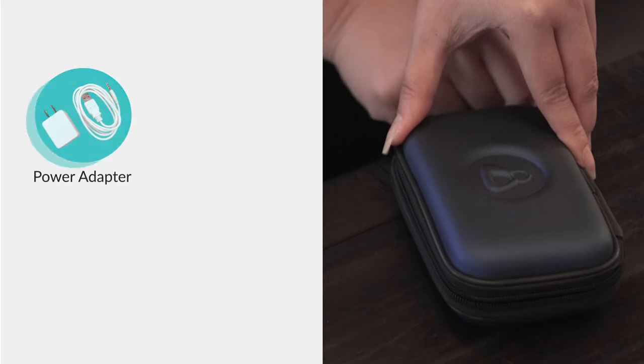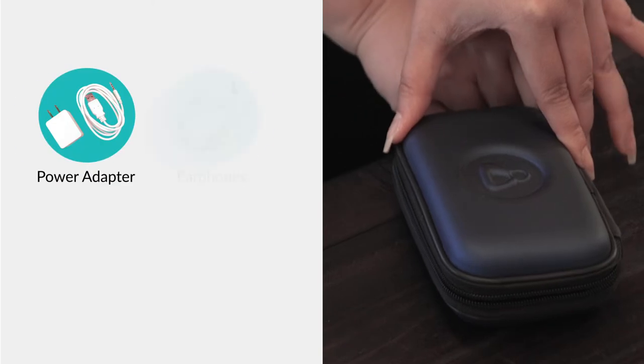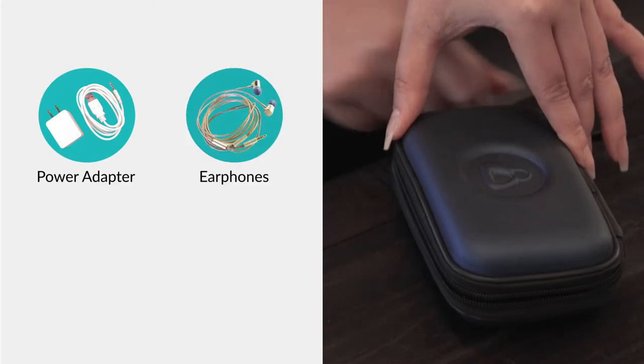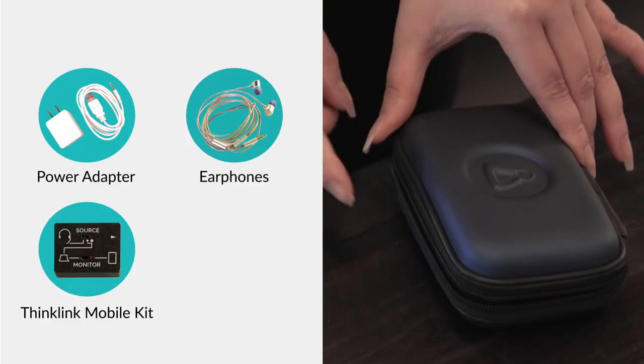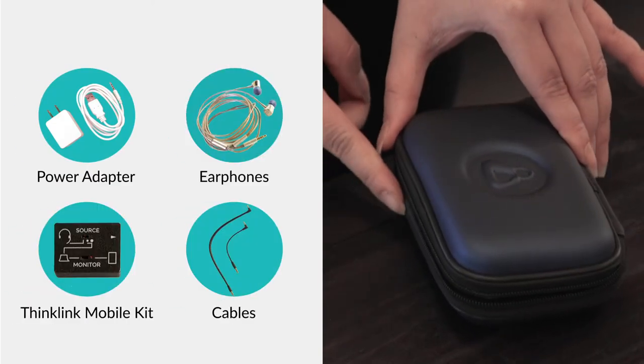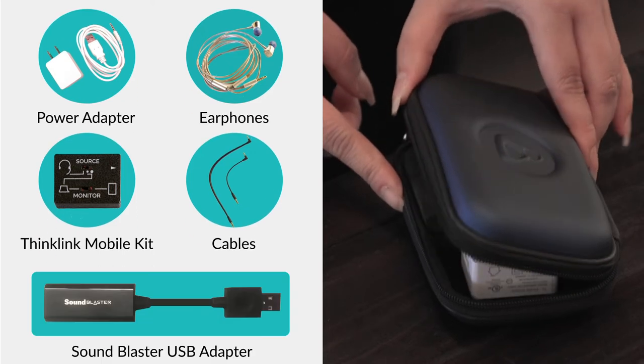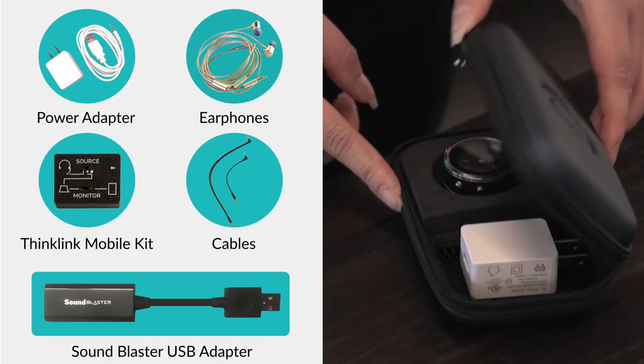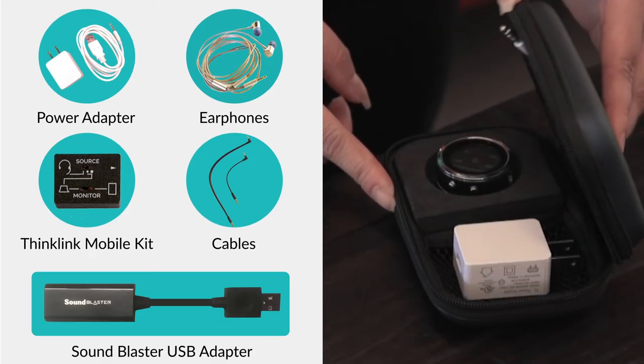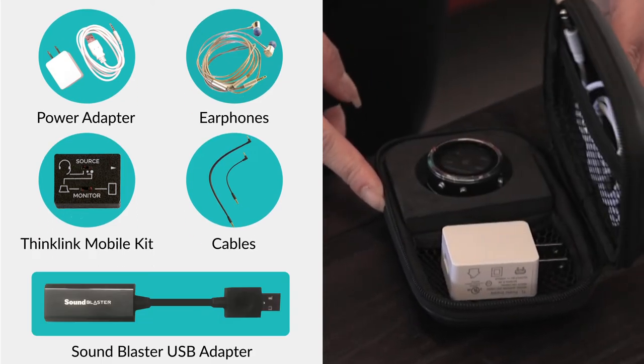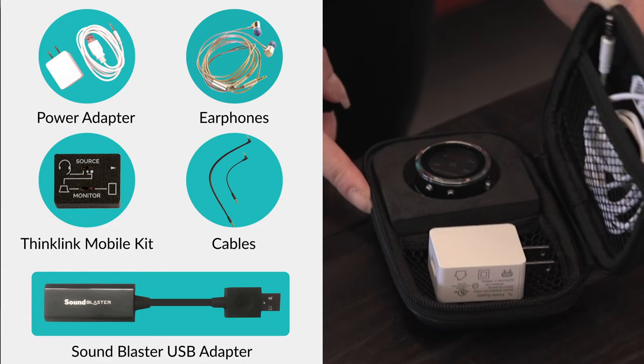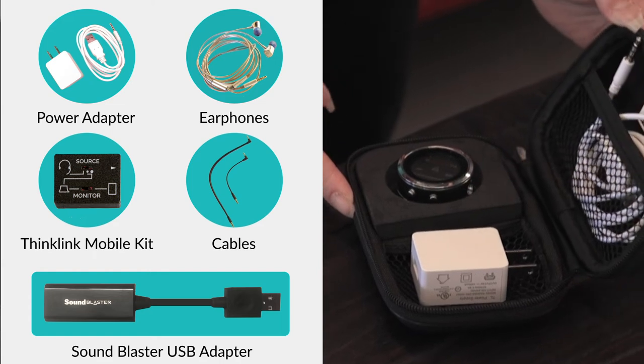The One Stethoscope comes with the power adapter, earphones, ThinkLink mobile kit, and cables. You will need to purchase the Sound Blaster USB adapter separately from Think Labs for better sound quality while using the stethoscope with a computer.